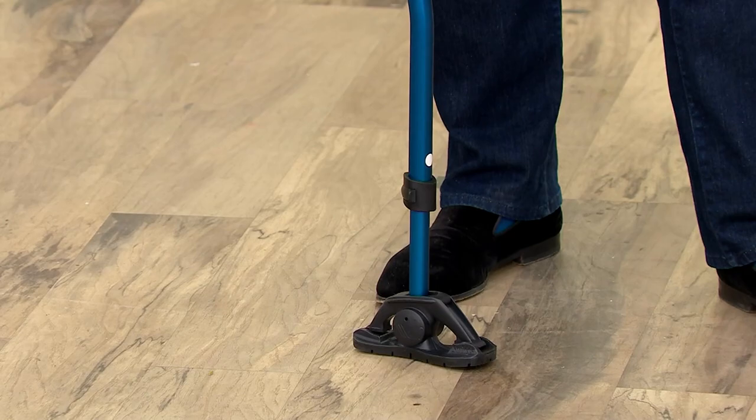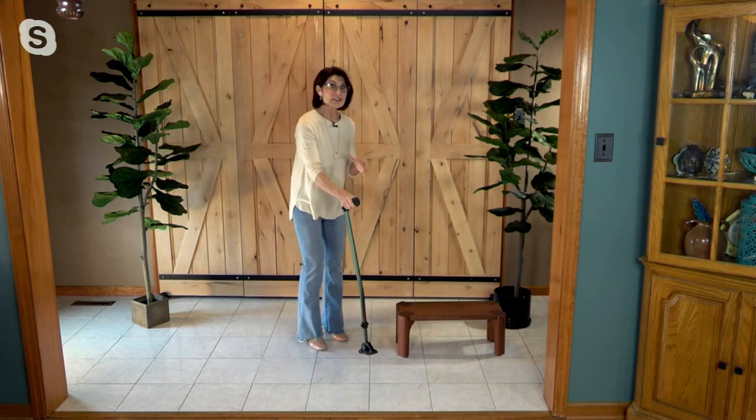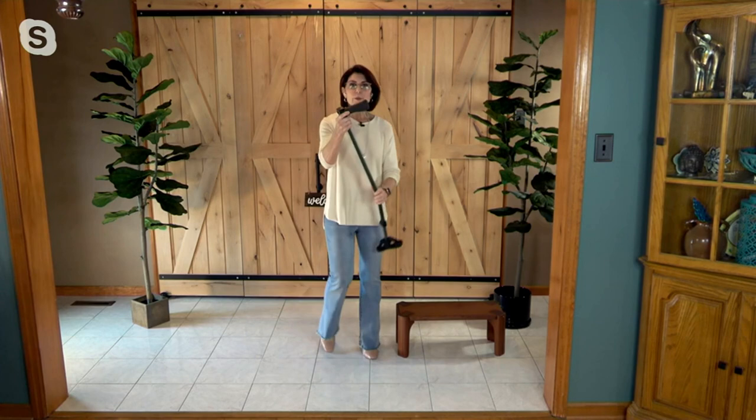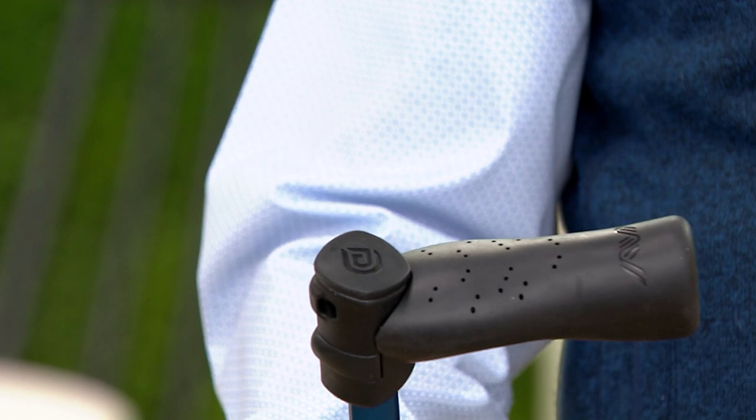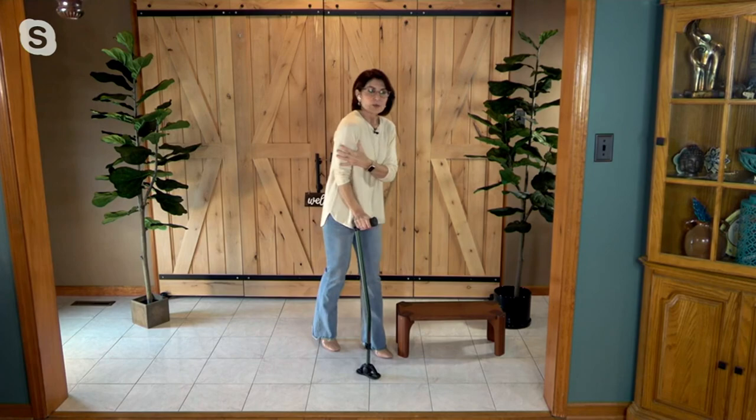You talk about the handle — it faces opposite the way we normally traditionally hold a cane. It's designed that way with a big, wide, soft, fat grip. It's all about the utmost in contact with your body and the ground, stability and balance. It feels good, it grips, it doesn't hurt the hand, the forearm, the wrist, or the shoulder. And then the crossbow bend is designed to offset the pressure that happens when you walk.